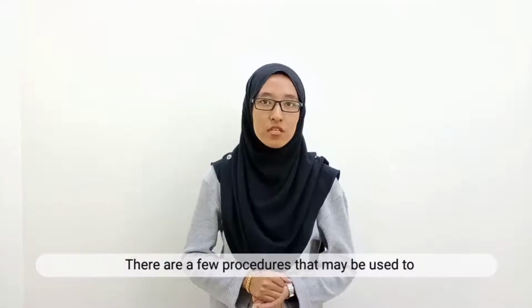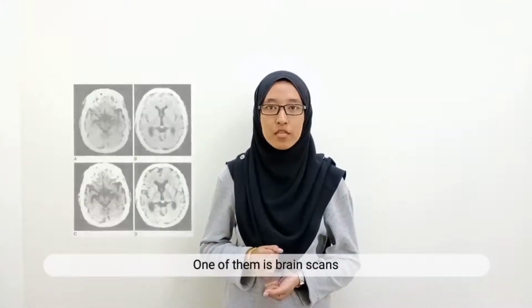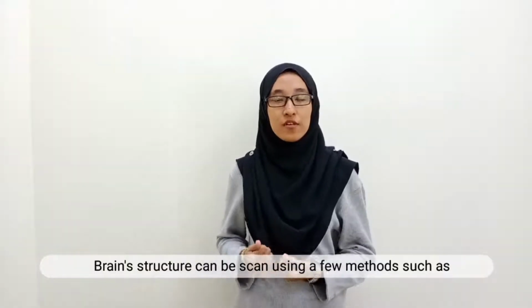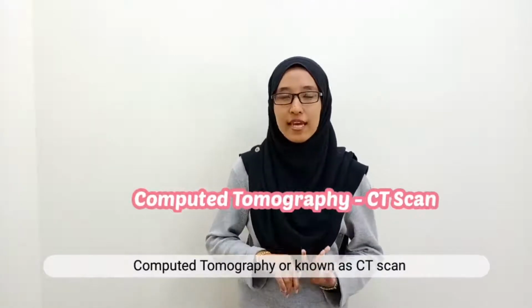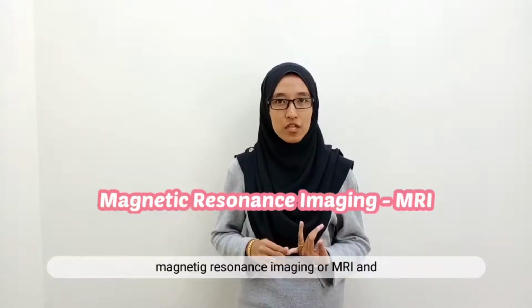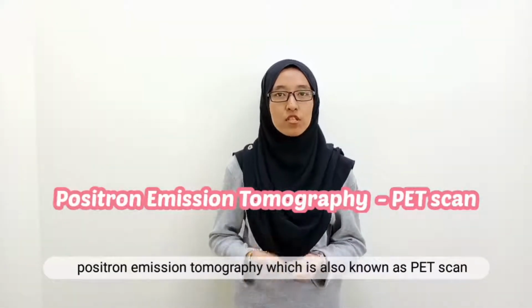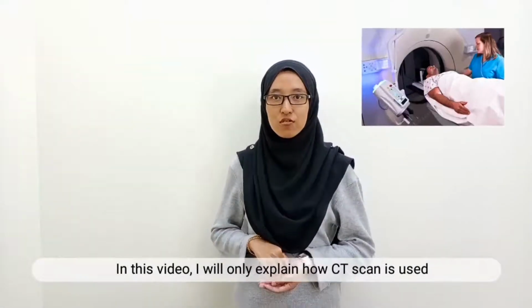There are a few procedures that may be used to diagnose dementia. One of them is brain scans. Brain structure can be scanned using a few methods such as computed tomography, known as CT scan, magnetic resonance imaging or MRI, and positron emission tomography, which is also known as PET scan. In this video, I will only explain how CT scan is used to diagnose the disease.